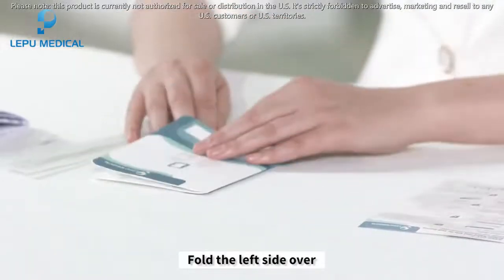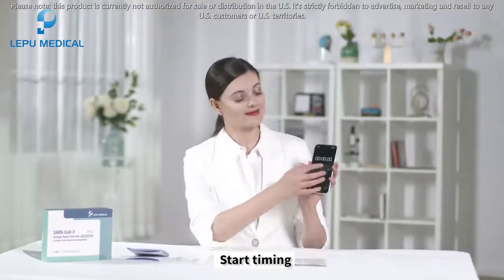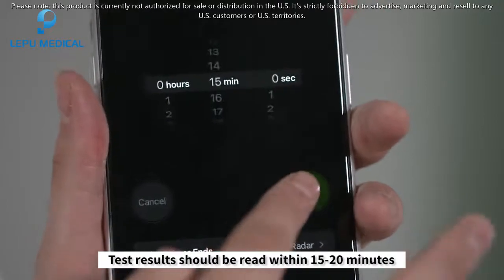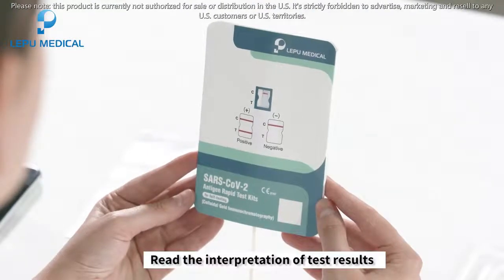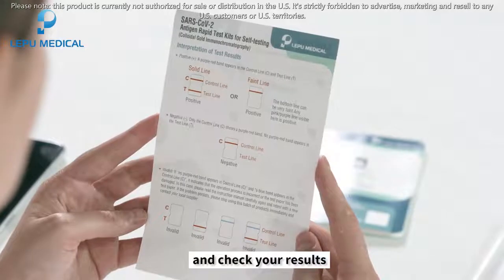Fold the left side over. Fit 2 sides together completely. Start timing. Wait for the appearance of purple-red line. Test results should be read within 15 to 20 minutes. Next, check your results. Read the interpretation of the test results on the operation test card and check your results.